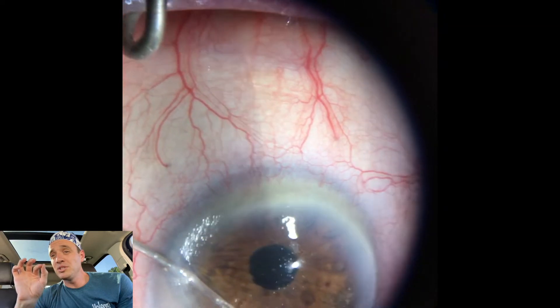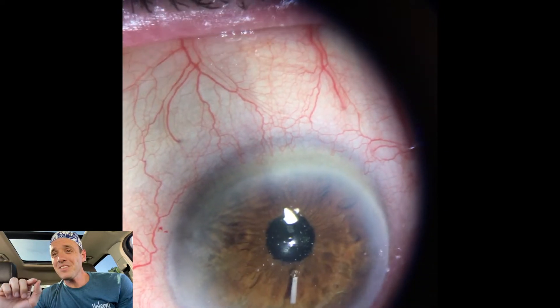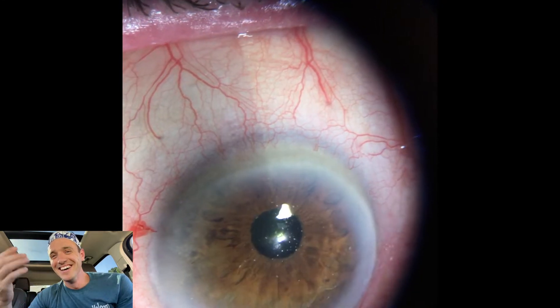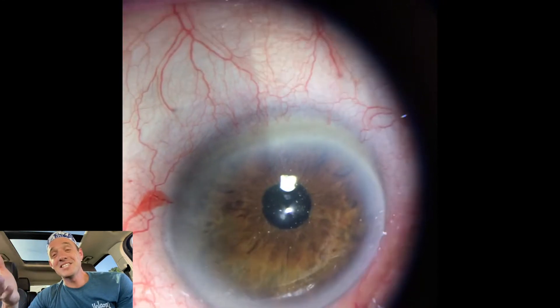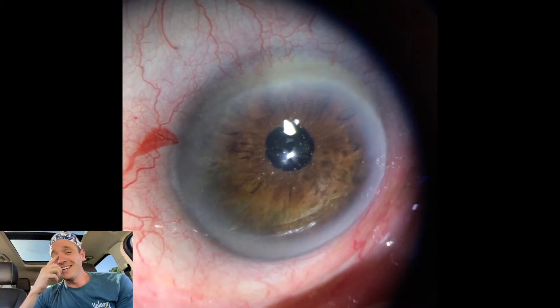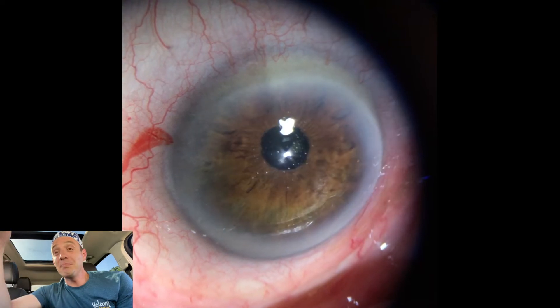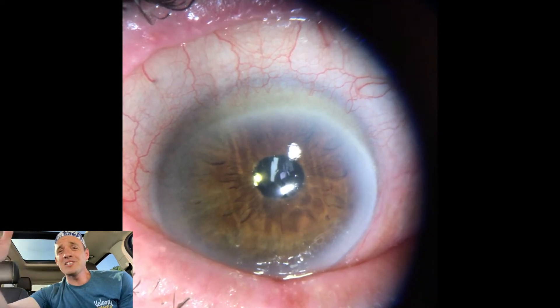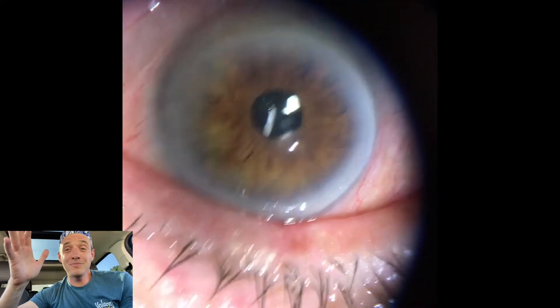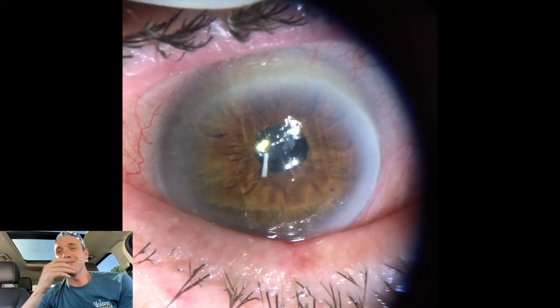Slow motion there — you can see the bubble on the leading edge, and it's going up, going, going, gone, in the sulcus. Is it a problem? No, it's not gonna be a problem back there. It's gonna be fine. There's no study, but it's not gonna be a problem. And then back down — you get a thousand points if you can shoot it up through the pupil with an air bubble, but to get it back down, that's another 10,000 points. Are you kidding me?